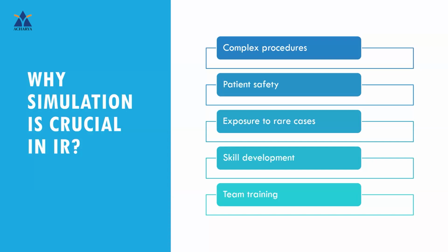And you can develop skills, that is, your simulation will help to practice and refine certain fundamental skills like catheter and wire manipulation, angiographic techniques for interpreting images and for managing complications. And then it will also enhance teamwork and communication. It will improve your team coordination.